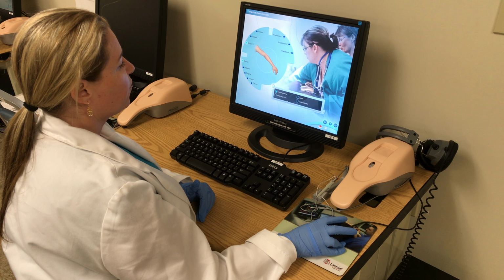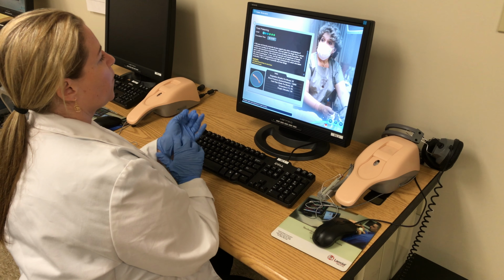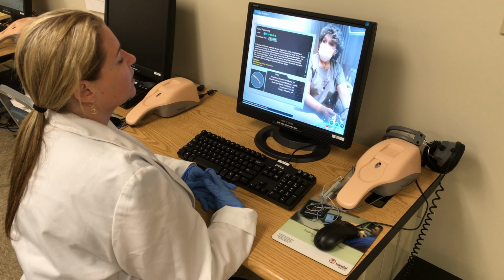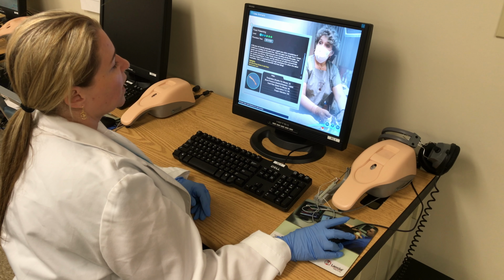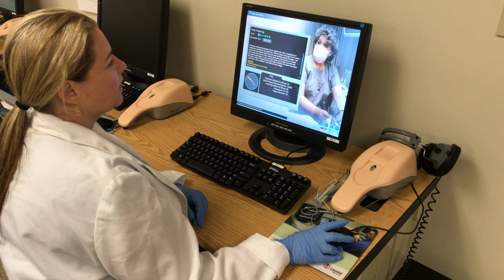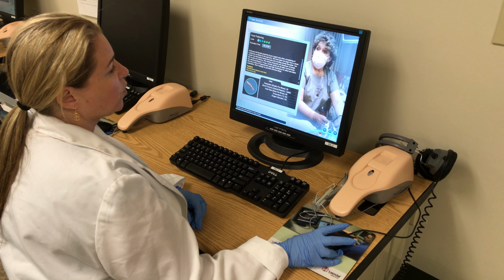Okay, we are going to go with the food poisoning first. You click your arrow to start, and then the screen will give you the case scenario. This is a 56-year-old female presents at your urgent care clinic complaining of continuous vomiting for the past hour. She has eaten hot dogs from the street vendor and developed abdominal pain and vomiting shortly thereafter. Her skin is pale and clammy. She denies chest pain and shortness of breath. Her electrocardiogram, x-rays, and lab values are all within normal limits.